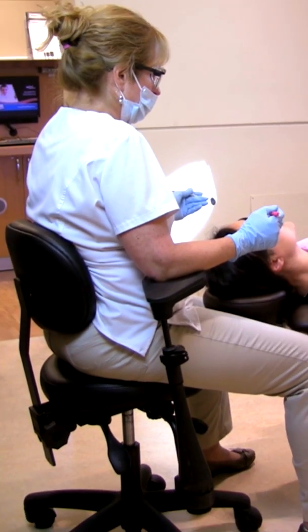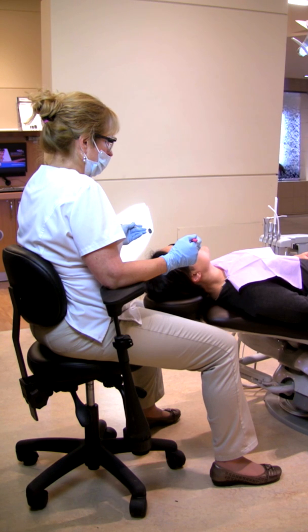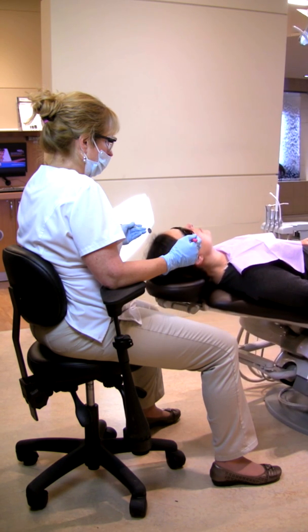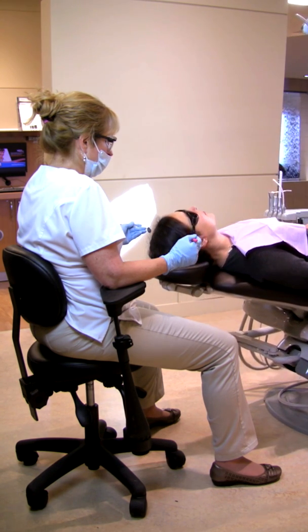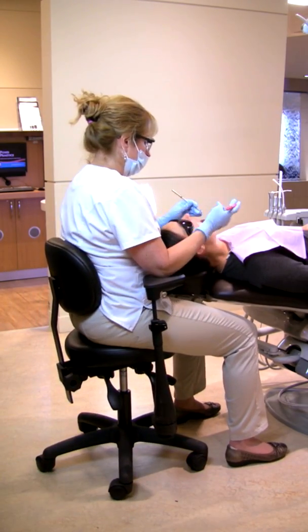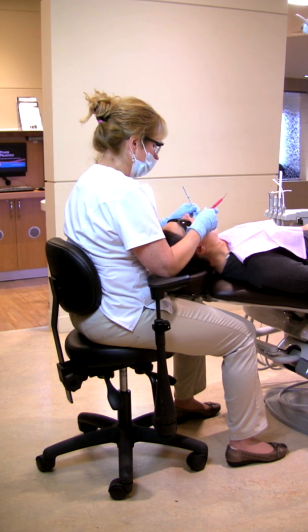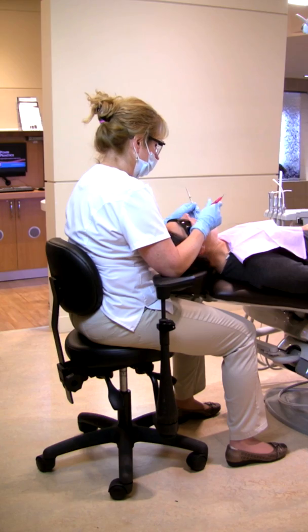To better your working position, raise the patient's chair to chest height and as horizontally as possible. Repositioning the patient chair in this manner will give you more leg room, get you closer to the patient, and angle your arms at other than 90 degrees in a better working position, while more importantly keeping your back and neck straight.